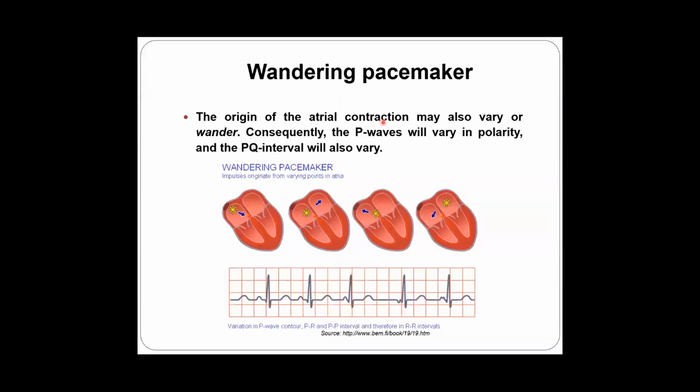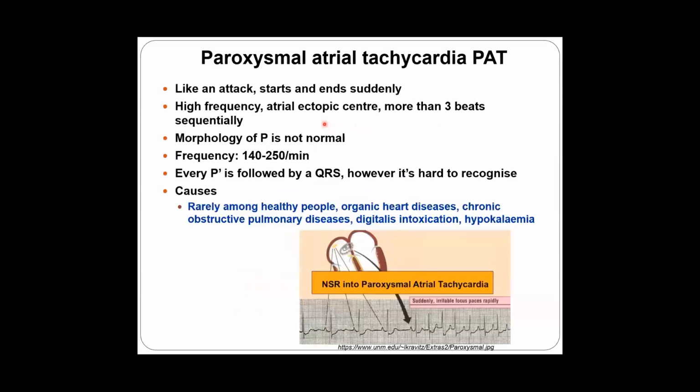Wandering pacemaker, okay, is when the sinus is continuously changing, or the depolarization wave is coming from the sinus to the AV and going back, and this is why you do have the P's constantly changing, going toward the AV, and after, going back. This kind of wandering pacemaker can be seen sometimes, and this is a variation, but it always means some kind of oxygenation abnormality.